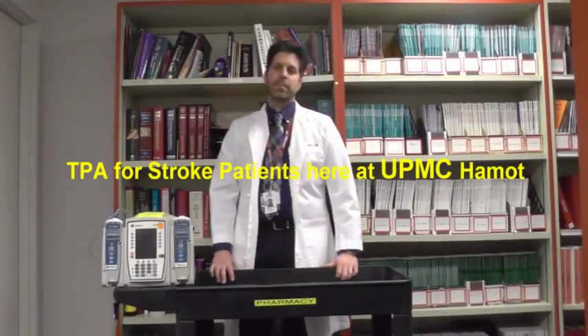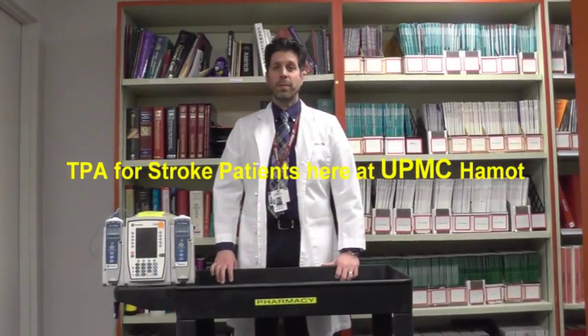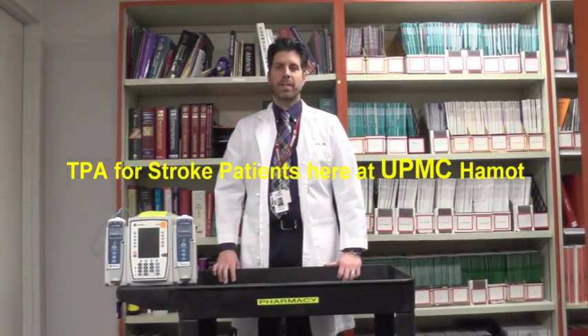Hello, my name is Romeo and I am a pharmacist here at UPMC Hammond. Today I'd like to go over the process of ordering TPA for patients who may have had a stroke, as well as the administration of the bolus and the maintenance dose, all through the Alaris pump.